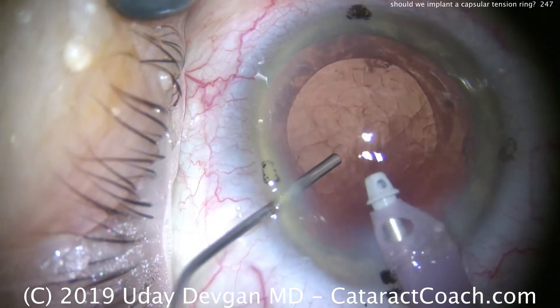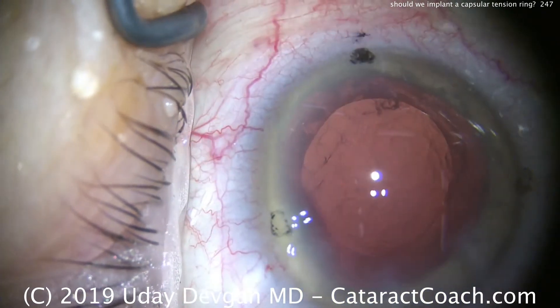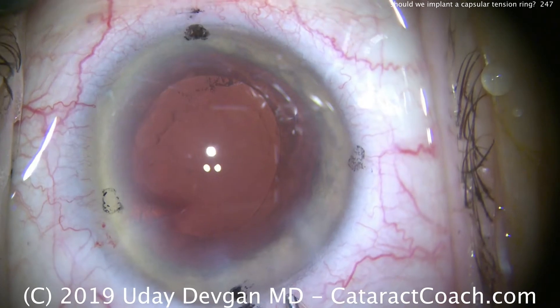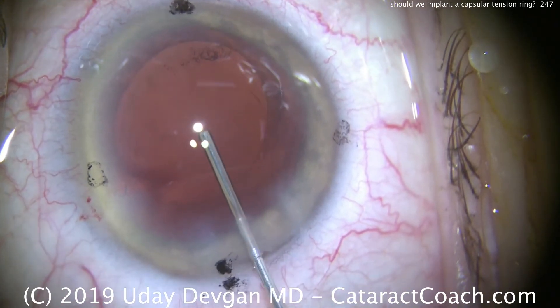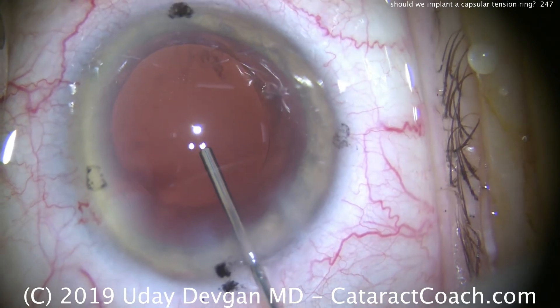Fill the capsular bag now with the cohesive viscoelastic. Let's put a little more in to get a nice, solid fill of viscoelastic. And we can see we still have our round capsulorrhexis, nicely centered, intact, and it looks pretty round.